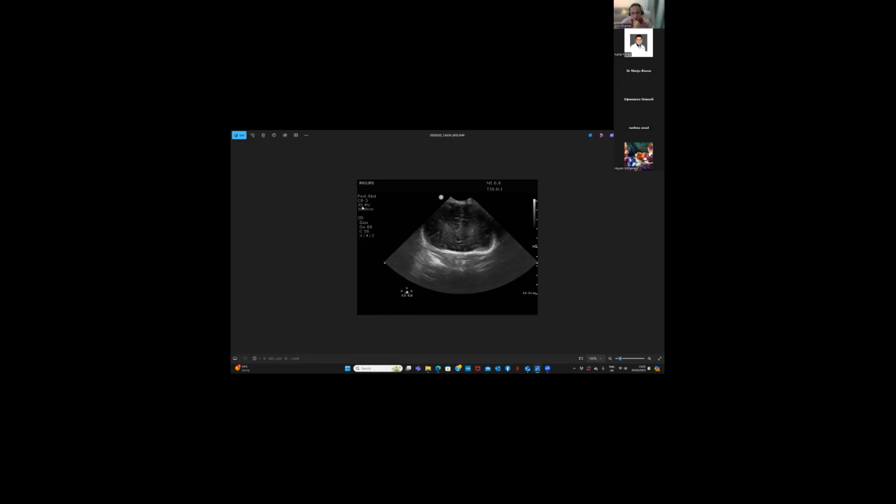I thought this was the frequency, 35 hertz. No, that's not accurate. You will never be able to achieve a frequency of 35 hertz. The highest frequency probes are about 20 at the moment. Your frequency is between 5 and 8, probably about 6 to 7. That's perfect. Carry on.